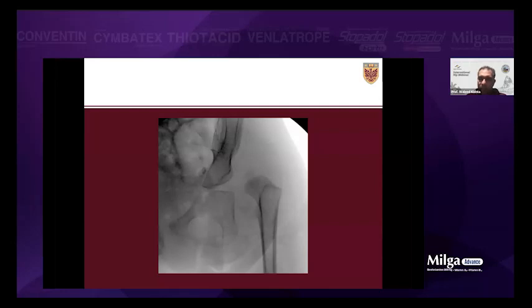Yeah, you can feel the interval with your finger. So either with your finger you feel the sartorius and you can get the interval, or if you want to start lateral to be safe from the nerve, then you get it from the lateral. But the trick: don't go through the muscle, otherwise you lose the interval.